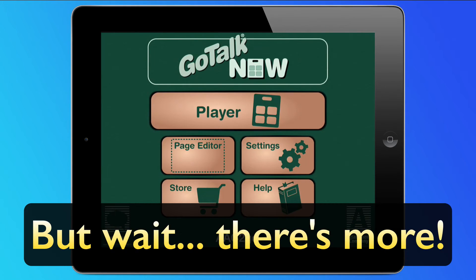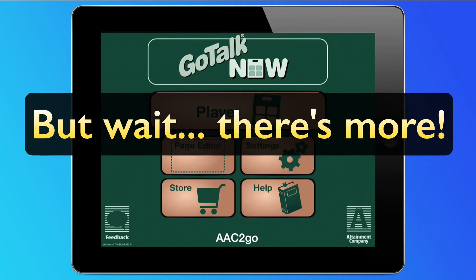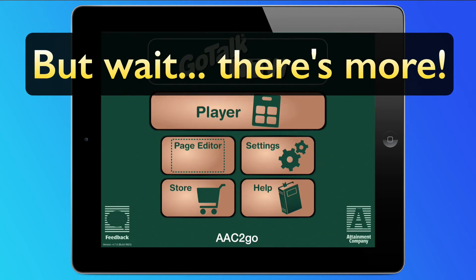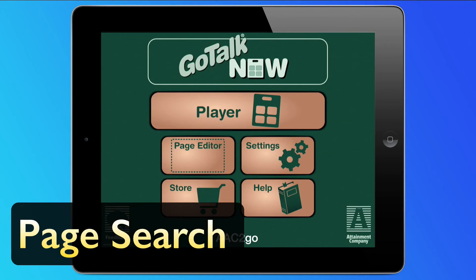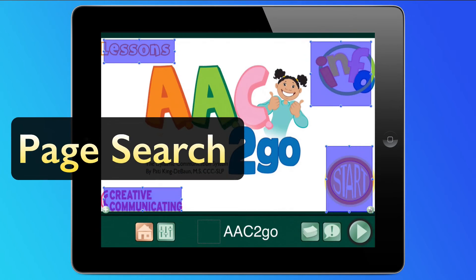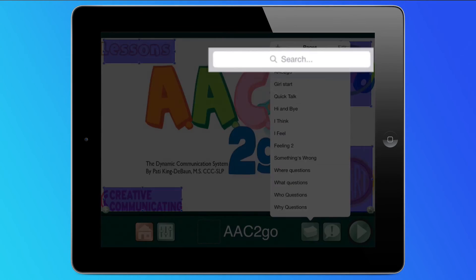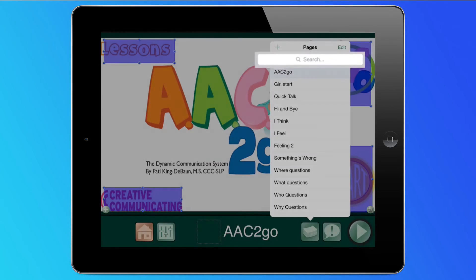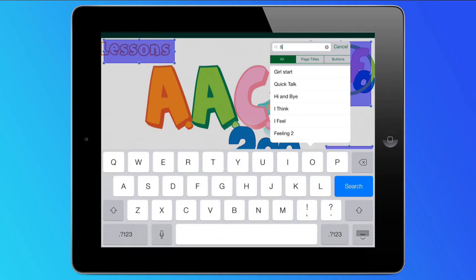And that's not all — we've made improvements to some of the existing aspects of GoTalk Now. A page search has been implemented. While editing, search by page title, button text, or text-to-speech message.